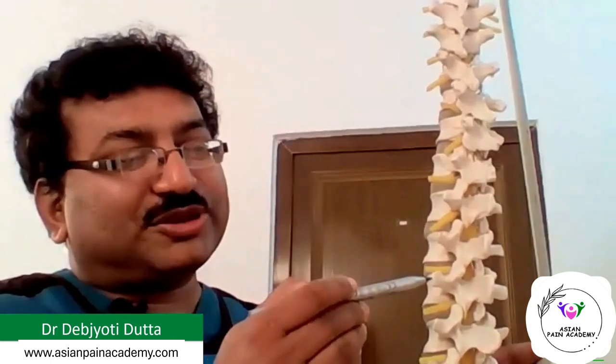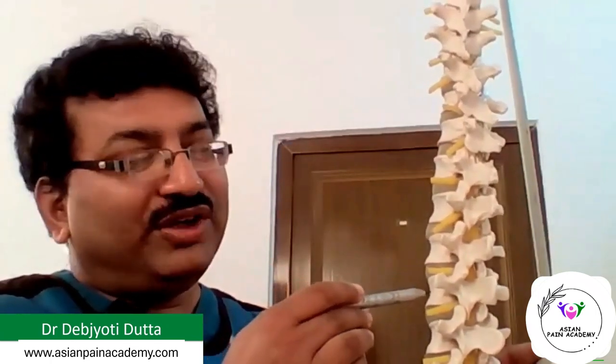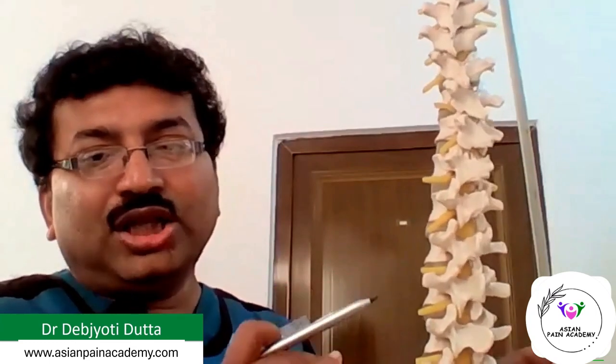Now, as in the lumbar level there is not much important structure, we can easily make it oblique. Like you can see in this picture, we are making it oblique so that the transverse process comes within the vertebral body. If your patient is sitting and we are taking an AP view from the back, it will be like this.